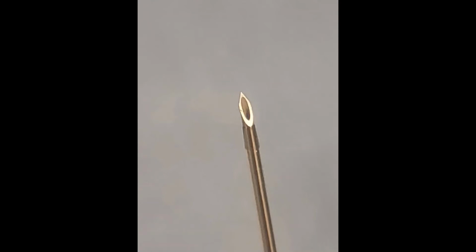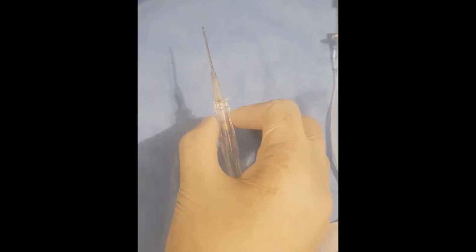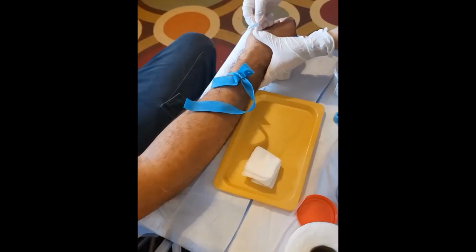Make sure that your intracath is bevel up. You want to hold the bevel up to allow the sharp tip to pierce the skin first, paving the way for the rest of the needle. Entering the vein beveled down causes a painful tear to the skin. Hold your catheter in a manner that allows you to see the flash or flashback in the catheter chamber, and later the needle flash. The flash is when the blood is returned as a result of hitting the vein.